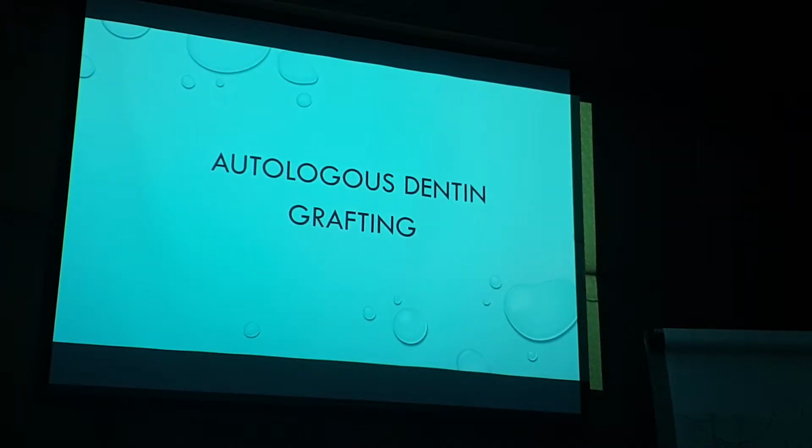How many of you have used autologous dentin, taking extracted teeth and grinding them down to use as a bone graft material? We do that in my practice. It's a great adjunct to this. Remember the case that I showed you, the grafted case where I placed implants? I did extraction, we did implant placement, but I had resorption of the facial plate. The way I prevent that today is to use an autologous dentin graft in the gap, because the autologous dentin does not resorb. It's like using a xenograft, except that because it's not a foreign body, it's a natural material, you get a different quality of bone that surrounds the dentin particles.